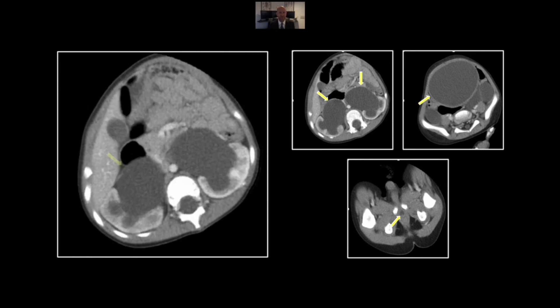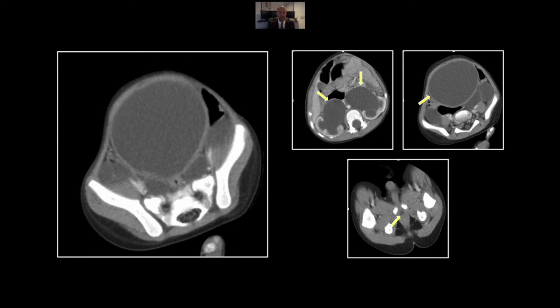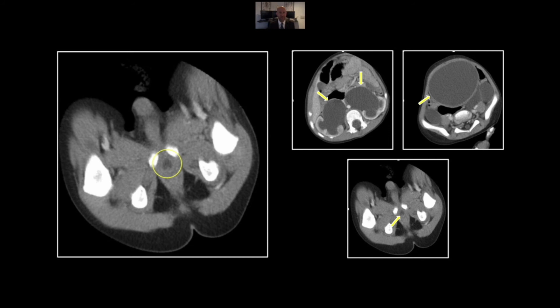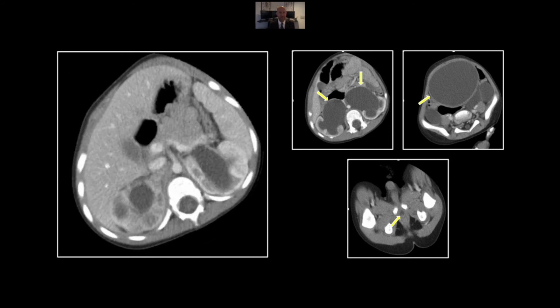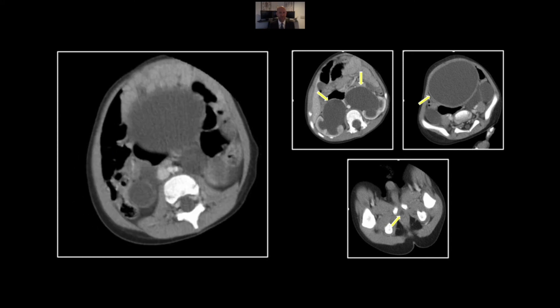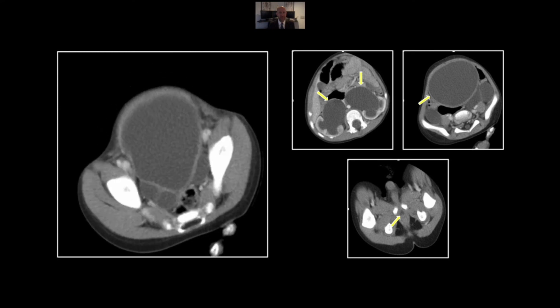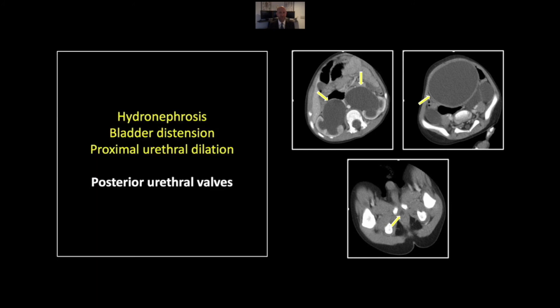We see again the hydronephrosis, the pronounced hydroureter, and the marked bladder distension. But right there is the critical finding: that proximal prostatic urethral dilation, denoting the presence of posterior urethral valves. Again, the ureters and marked bladder distension, but right here, the critical finding. That is a case of posterior urethral valves causing chronic outlet obstruction.